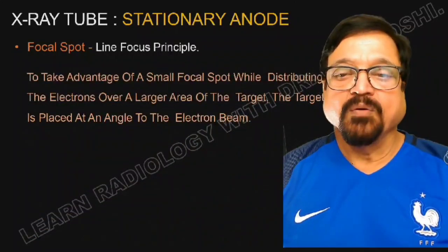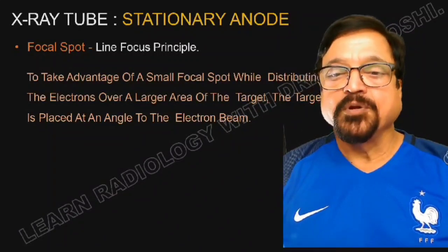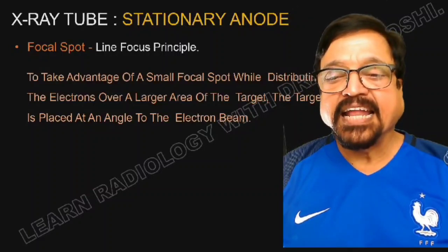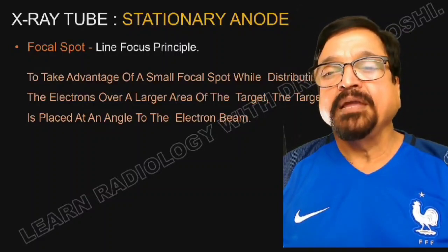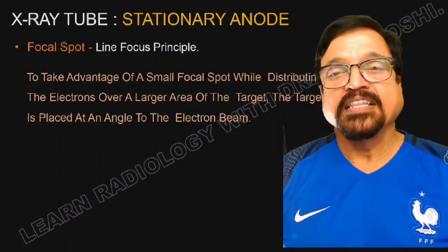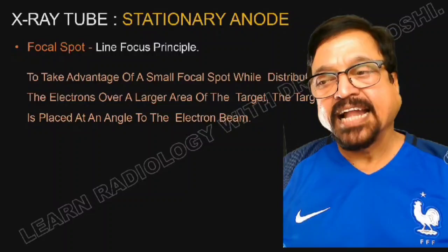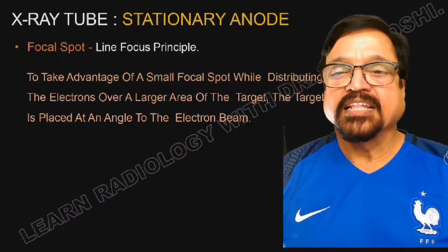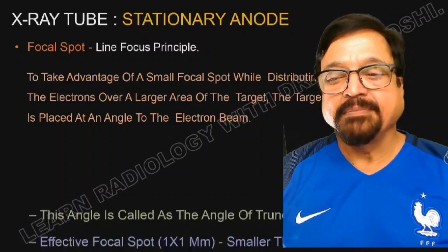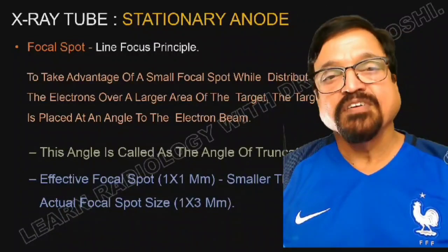Now further, regarding the focal spot, there is a line focus principle. What is it? To take advantage of a small focal spot while distributing electrons over a larger area of the target, the target is placed at an angle to the electron beam that bombards it. That is what we have seen. When we saw an anode, there was a wedge, a slanting. That shape is given so that the line focus principle can be achieved.